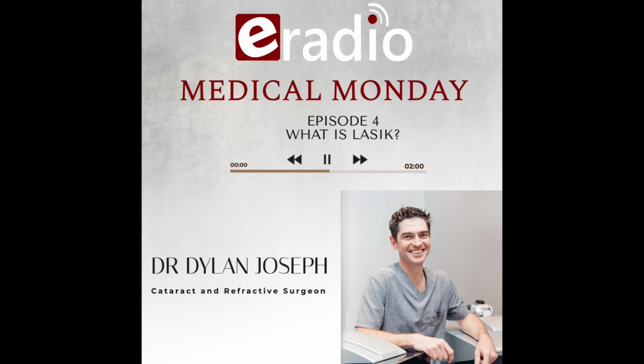And people think that when you're doing laser vision correction, you're actually burning. And that's why they notice what they describe as a little bit of a smell. So I tell all my patients that during or before laser, you're going to hear the machine make a buzzing noise and you're going to smell what you think is a burn. But it's not burning the tissue. It's actually a cool ultraviolet laser. So all it's doing is causing evaporation of tissue.